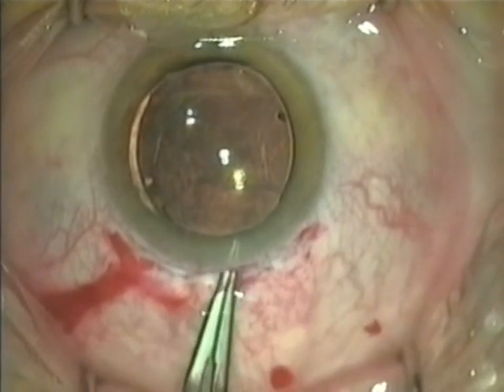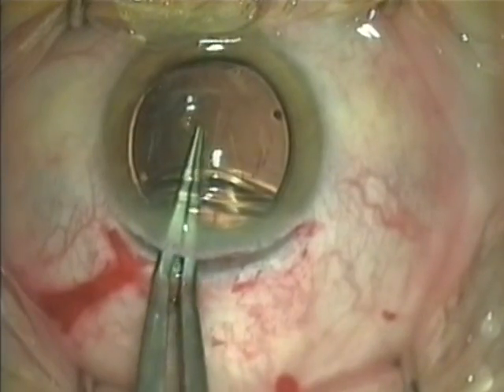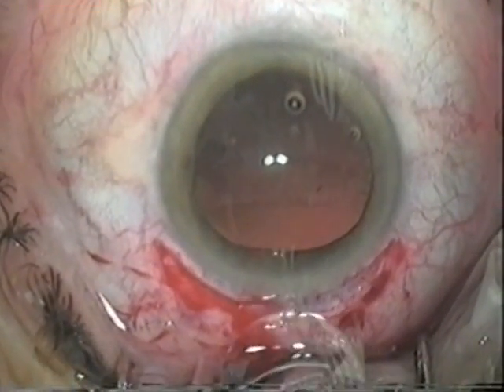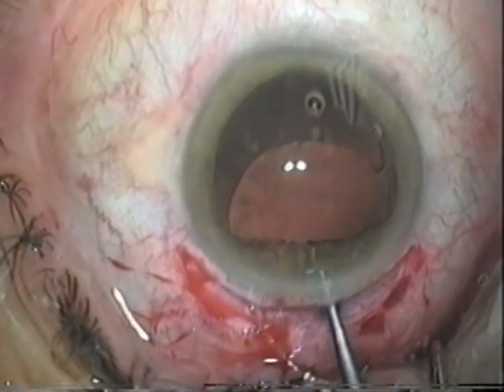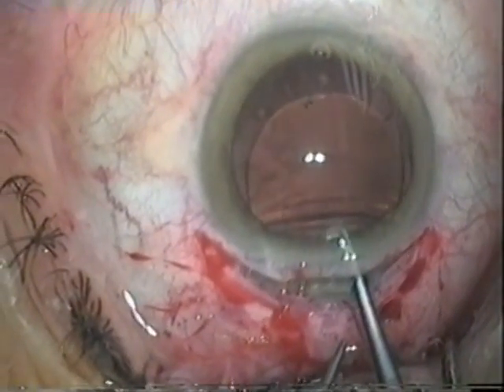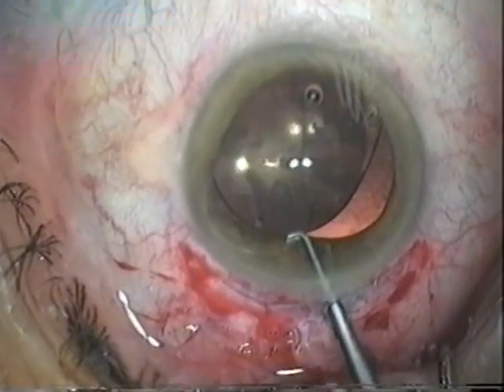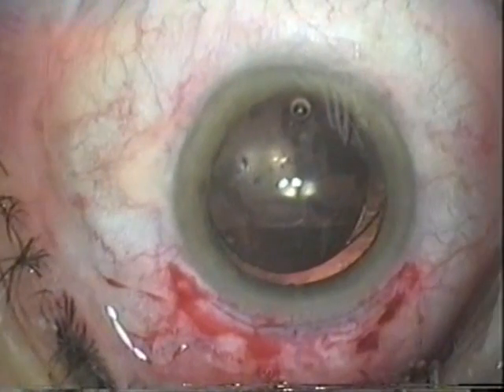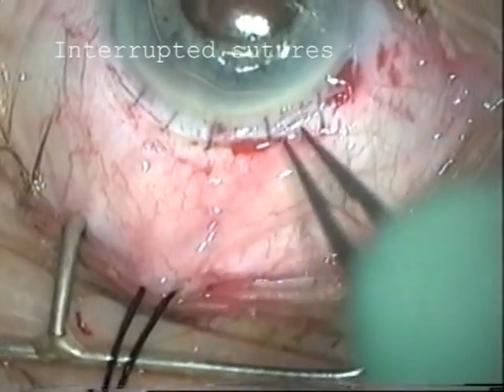The capsule can then be gripped with a pair of fine forceps and torn across. In this second approach, the leading haptic is placed in the bag as before, and the lens is rotated by grasping the upper haptic and rotating it round. The upper haptic is placed in the capsular bag. Now three to four further radial sutures are placed and rotated to bury the knots.